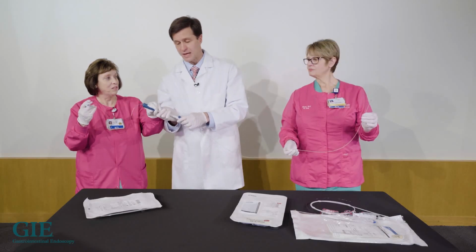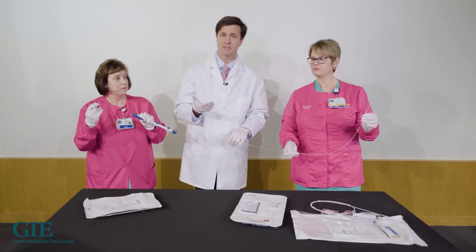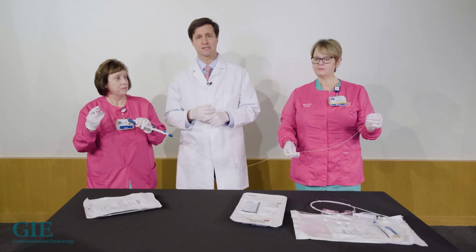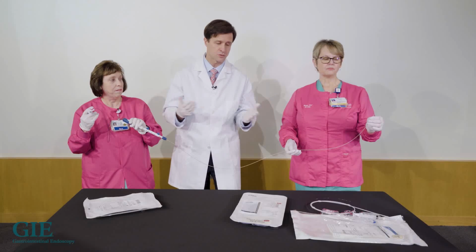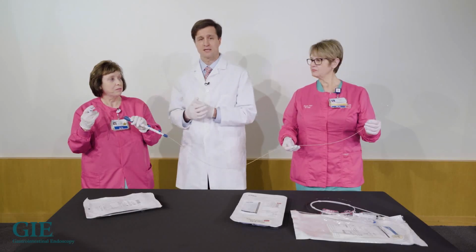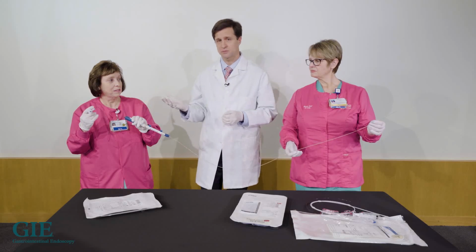So once it's out, then you're going to biopsy the side of a cyst wall, the mural nodule, the solid portion of the pancreatic cystic lesion, which is the purpose of the tool. So when you do this, you'll actually have a tactile sensation. I'll let Pat talk about that from the technician or nurse perspective.